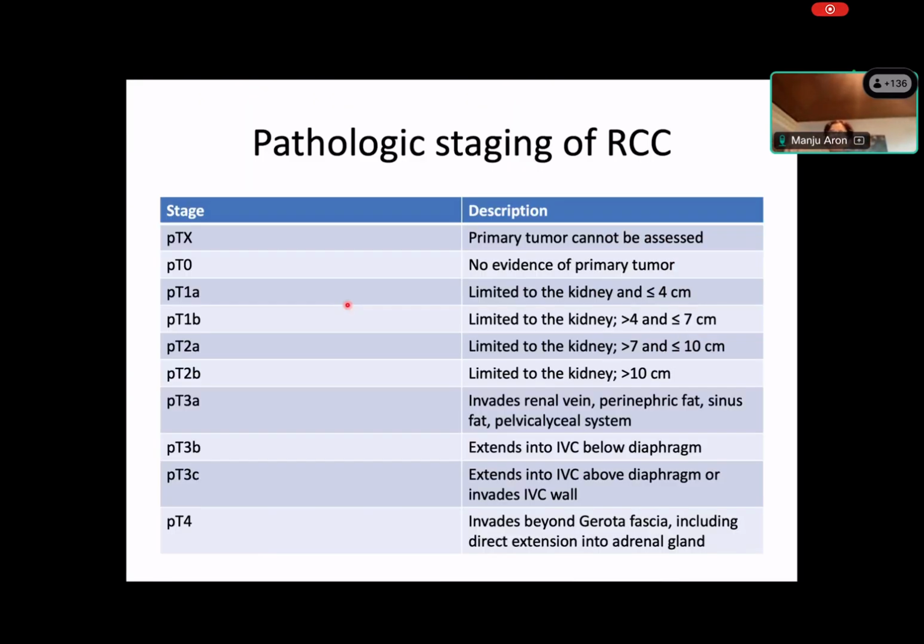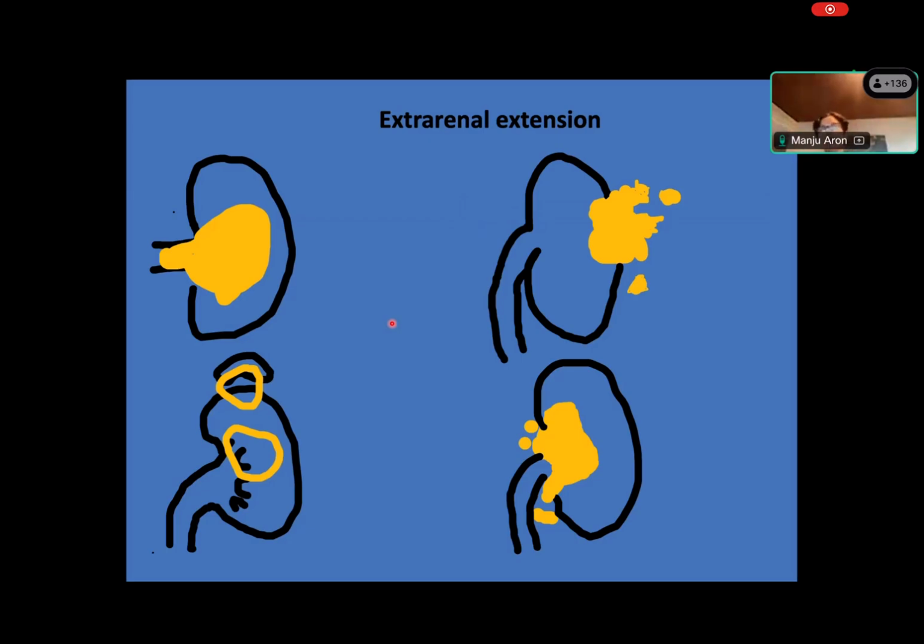Now, here is the staging of clear cell RCC. I have briefly gone over it in my initial presentation on gross evaluation, but I'm bringing your attention to the fact that if you have a tumor that's limited to the kidney, then the size is important. And the cutoffs, remember, are 4 centimeters, 7 centimeters, 10 centimeters. Those are important cutoffs. Once the tumor has gone outside the kidney, the size really doesn't matter, but when it's limited, remember that. I have already gone through extrarenal extension, how you look at it and evaluate it grossly, and to make sure you take extensive sections to document that.